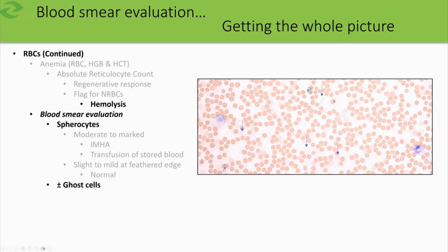If you notice in this one, all the red cells kind of look like spherocytes, but less than 1/3 of the cells are touching one another. So we're in a really thin area of the smear. Additionally, the cells here are staining orange instead of that nice pink-red color, and the leukocytes are understained too.